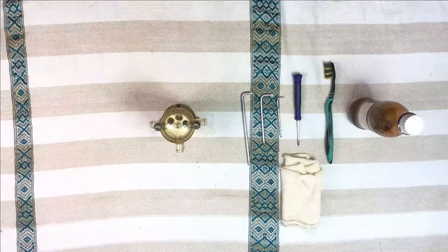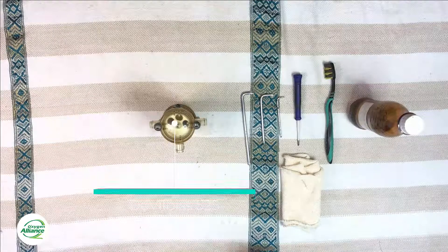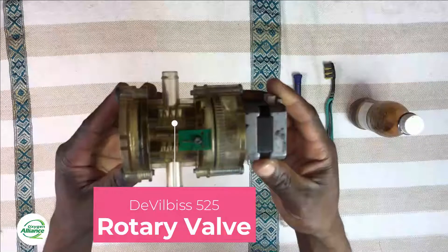Today I'm going to be explaining how to disassemble, clean, and reassemble a rotary valve from DeVilbiss concentrators. The rotary valve found in the DeVilbiss 515 and 525 are the same model, so this video covers both of these models. With me here is a rotary valve that we took from a DeVilbiss 525 oxygen concentrator.